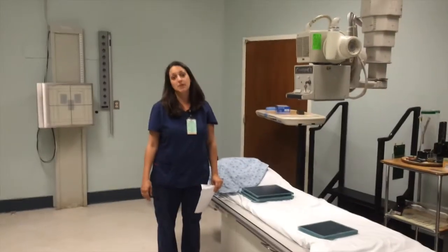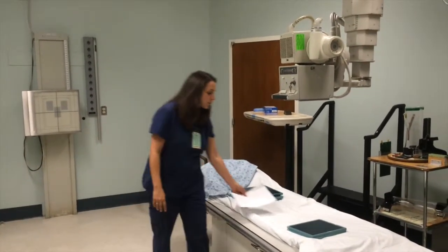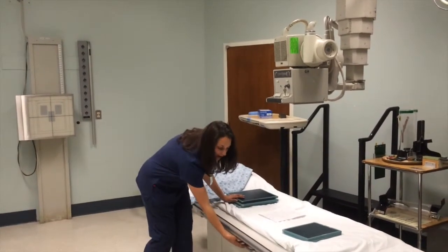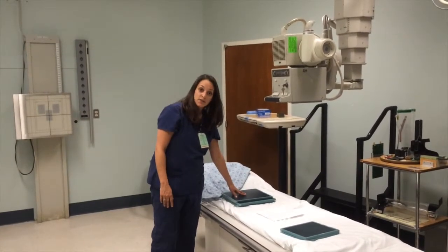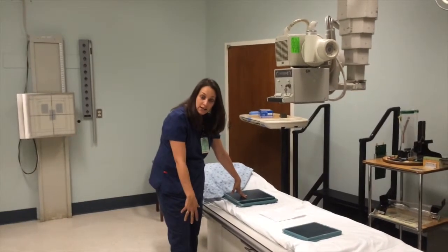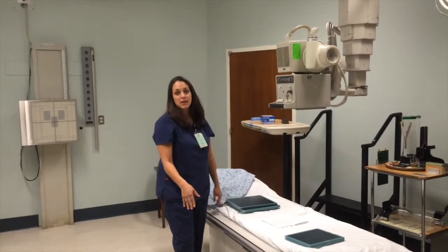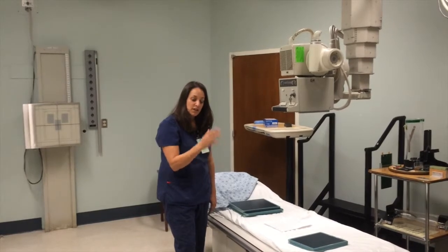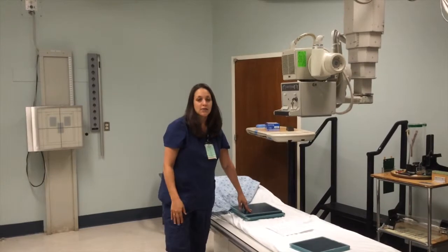My name is Marissa. Today I'm going to be doing 5 views on my patient's knee. The first 3 views are going to be in this bucky, which is the table bucky, and I'm going to be using 10 by 12s for those first 3 views. The first view is going to be AP knee, and then I'm also going to be doing an AP oblique knee, where it would be 45 degrees with medial rotation. And then the last one is going to be a medial lateral knee.